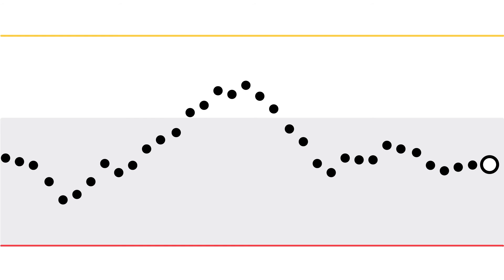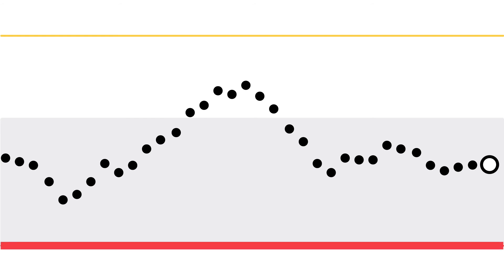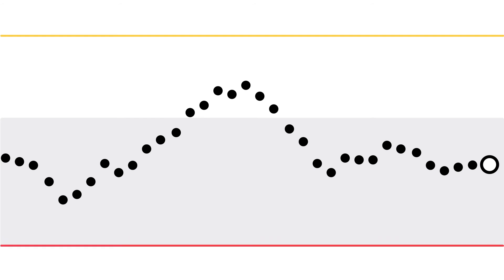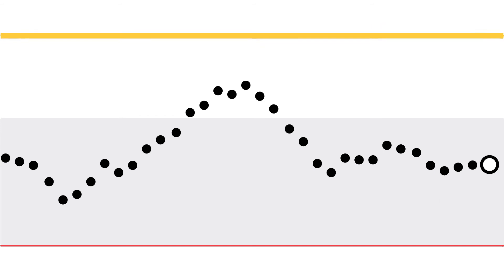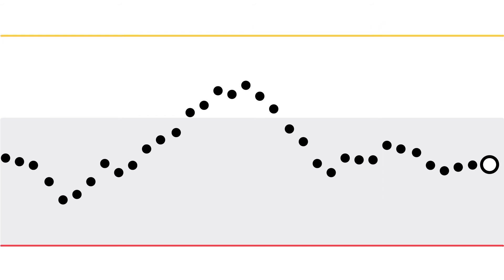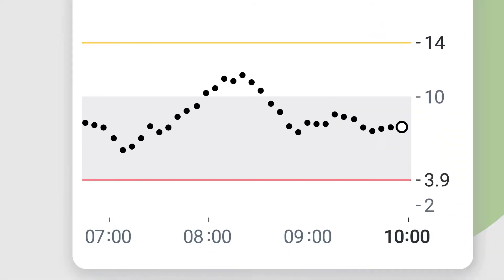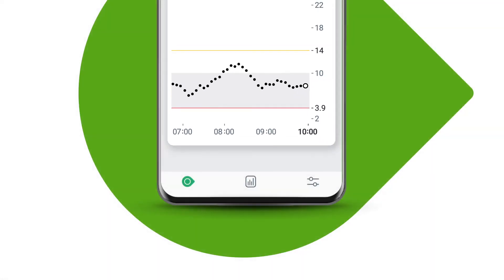Your low alert is the red line on the glucose graph and the yellow line is your high alert. If you don't see the red and yellow lines, your alerts are off. You can turn them on under settings.